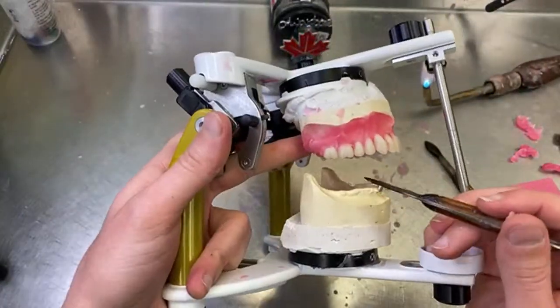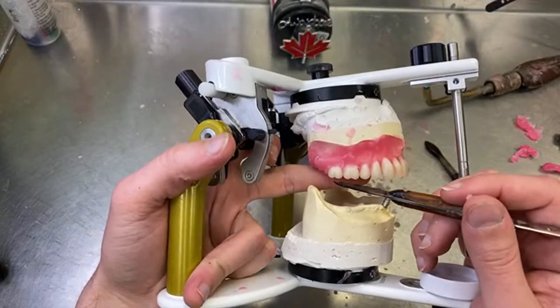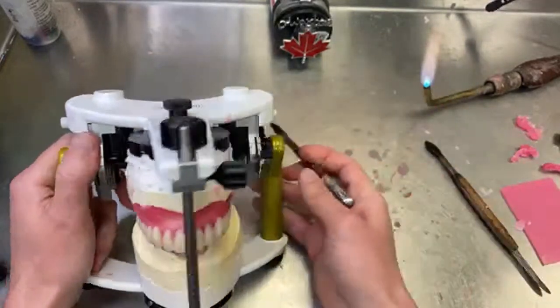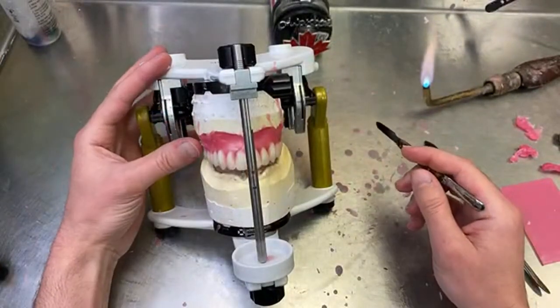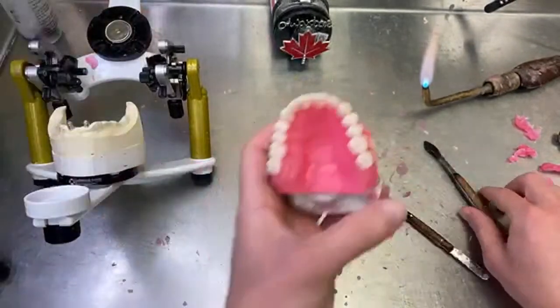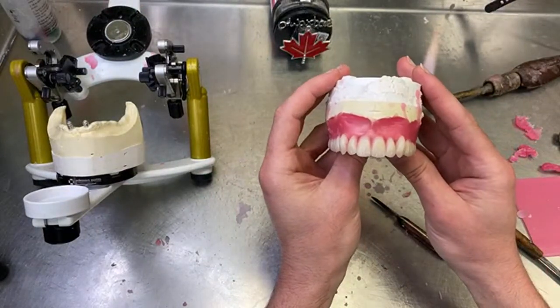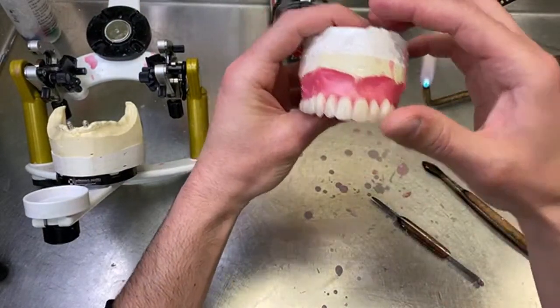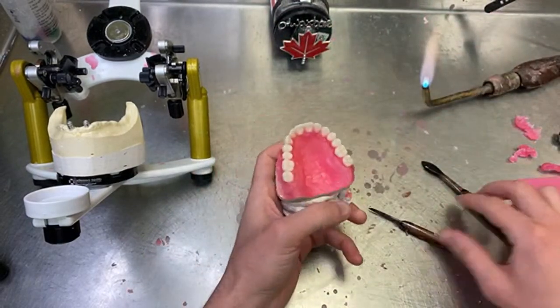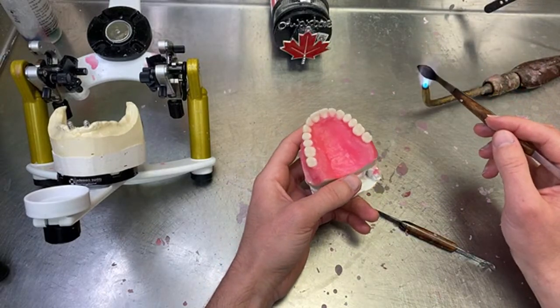So you see here, I don't know if you can notice it, but here, and then it went up a little bit. Just a little, not crazy. And that will give you that natural curve and also an easy setup on the lowers. So now the upper is set. You can see flat lines on the ridge, looking good. Those canines may look like that to you, but once they're in the mouth, they will look less aggressive. Now I'm going to seal this in place and I'll do the lower quickly.